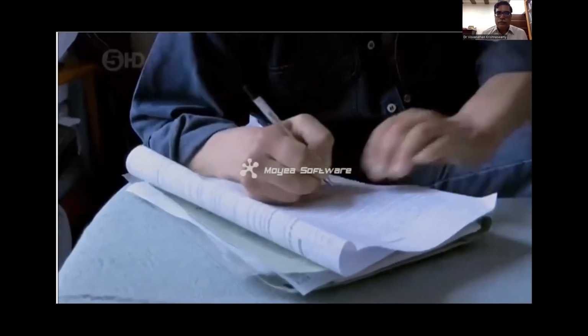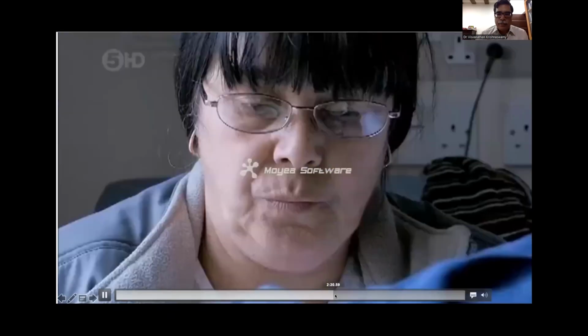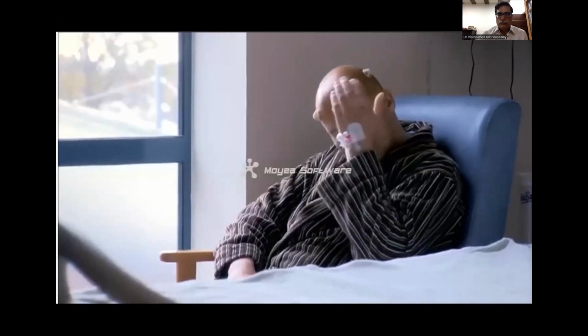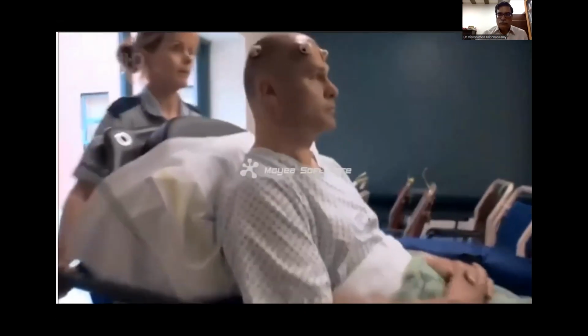This has been a buzz of excitement. He's unable to sign as well, as you can see. A typical operation has about 10 or 15 different steps. This probably has 10 times the number of steps, and each step is very critical because we're trying to deliver an electrode into an area with dimensions in the millimeters. So every step is important, and every step, if it goes wrong, can wreck the whole operation.